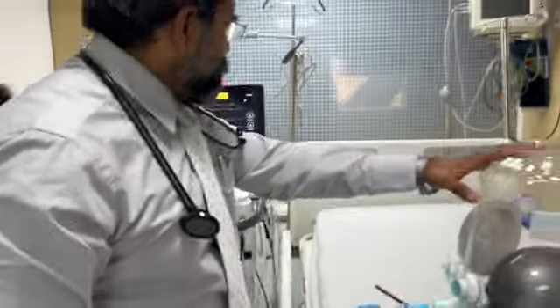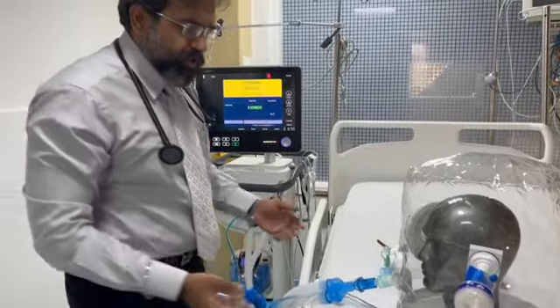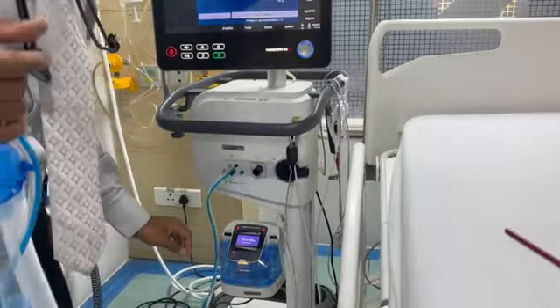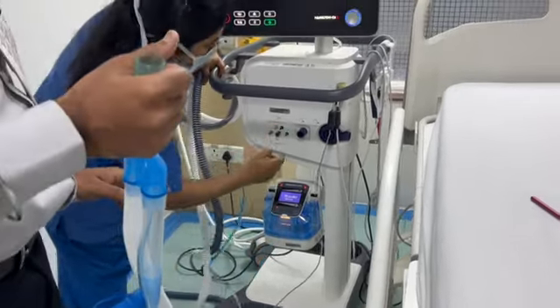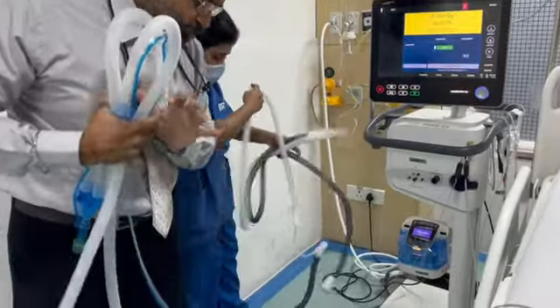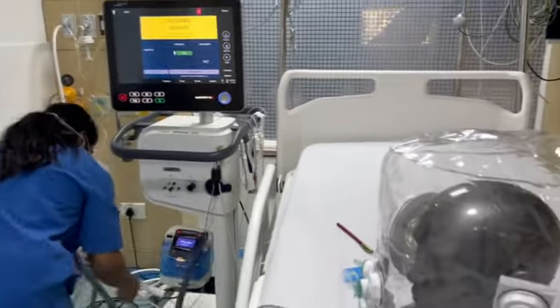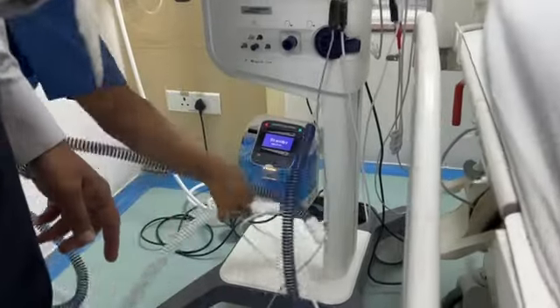So we're switching this off as of now, and we're going to connect this to the circuit, which is a high flow circuit. So let's look. I'm taking out the ventilator circuit from here. It's not required anymore. And I'm going to connect the regular high flow circuit to this. We should know this. So taking out the entire ventilator circuit, I'm going to use the high flow. You may wish to use any high flow that you have in your hospital, but we'll just see how the settings look. Okay, so there we connect the high flow circuit here.